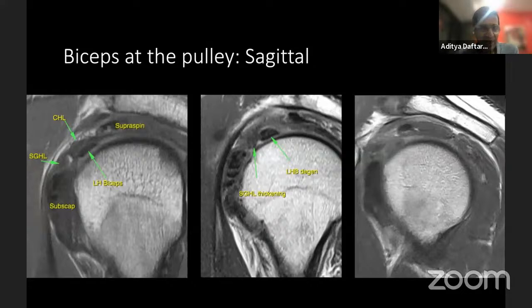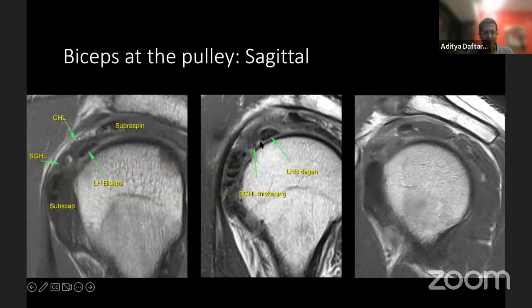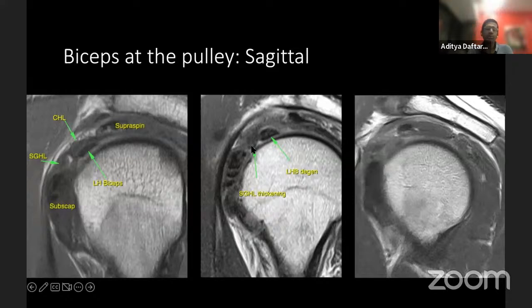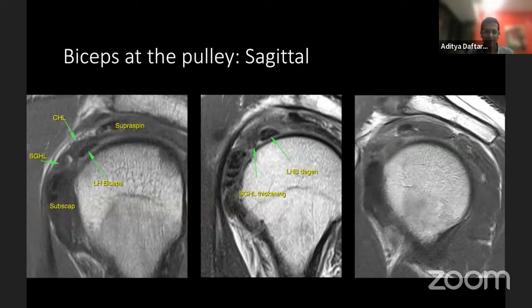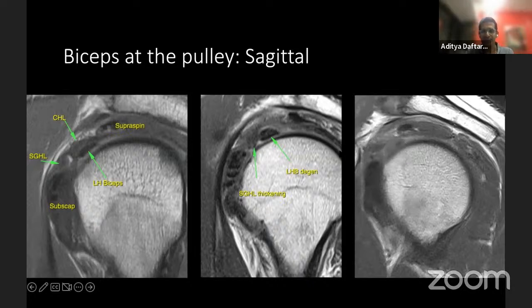Looking at sagittal images, you can see the supraspinatus, long head biceps, coracohumeral ligament, superior glenohumeral ligament, and subscapularis. In one case, the superior glenohumeral ligament is significantly more thickened than normal — this is what you would potentially see in early adhesive capsulitis. You can compare a normal small ovoid biceps to a slightly thicker biceps with intrasubstance signal indicating degeneration, and then a case where the biceps is simply missing, indicating a long head biceps rupture.